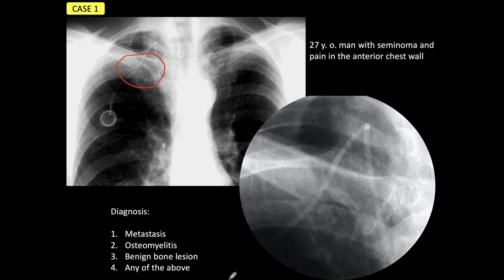Let's analyze the lesion. There is an obvious lytic lesion that is eroding the lower part of the proximal right clavicle. But there is an important finding here: the lesion has a sclerotic border that you can see very nicely. A lesion with a sclerotic border is, by definition, benign. So if it is a benign lesion, we can exclude metastasis and we can exclude osteomyelitis.